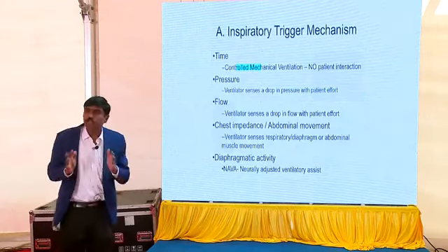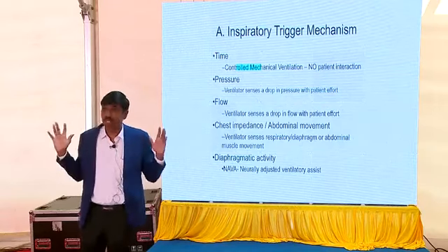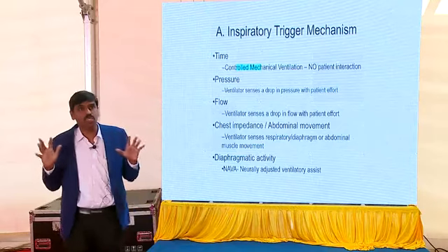Okay. Now coming to the trigger. Now we are moving more and more toward synchronized ventilation, where you let the baby control its ventilation. Before, we were controlling everything. Then we found that asynchrony is one of the biggest causes of lung damage.